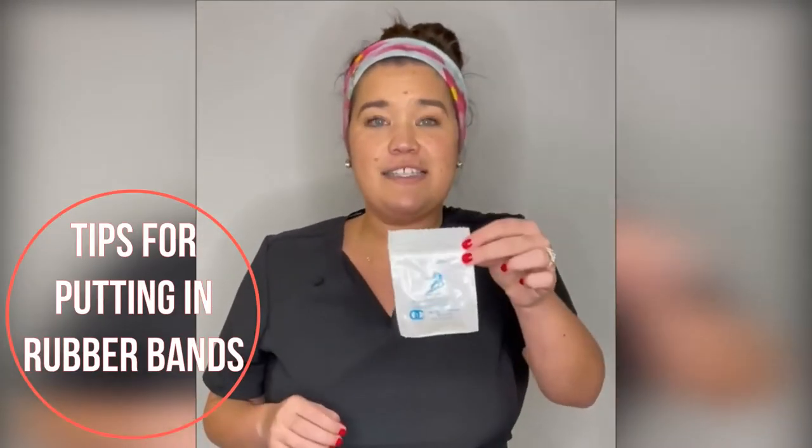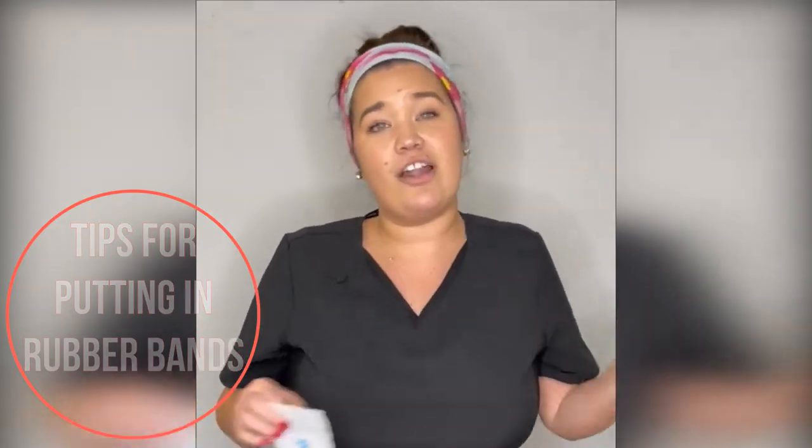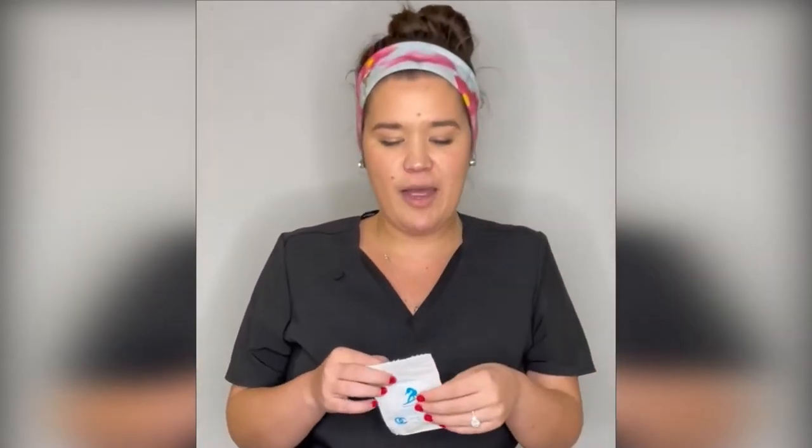If you have braces, you're probably gonna see something similar to this — we either call them rubber bands or elastics. A lot of times they're kind of tricky to get them to stay, especially when they're in the back of your mouth. I'm about to show you some tips and tricks that are gonna make it a little bit easier for you.